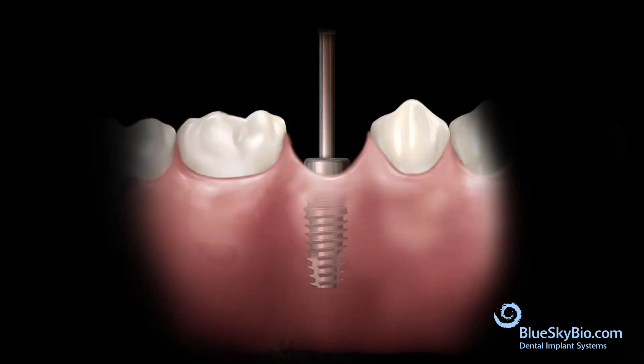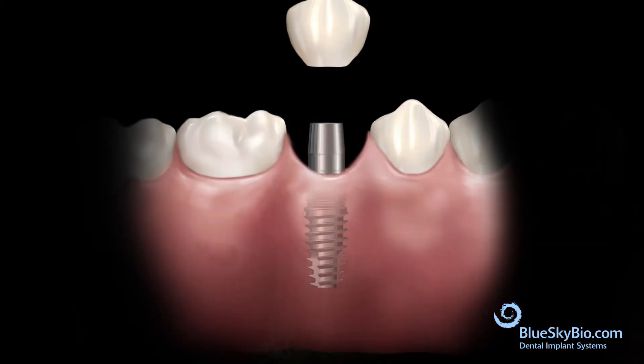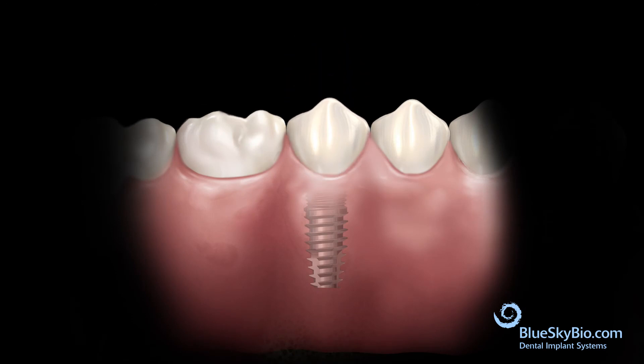Remove the healing abutment. Insert the abutment into the implant and tighten the screw with the ball tip screwdriver using light finger pressure. Place the crown on the abutment and remove any interproximal and occlusal interferences.